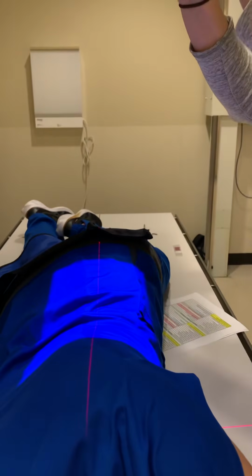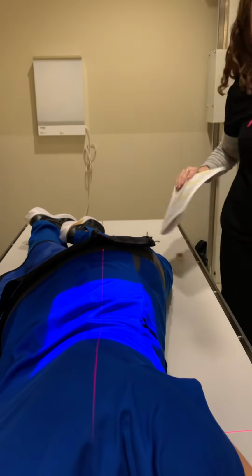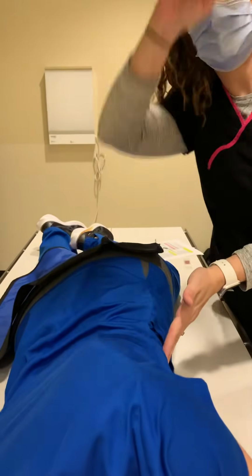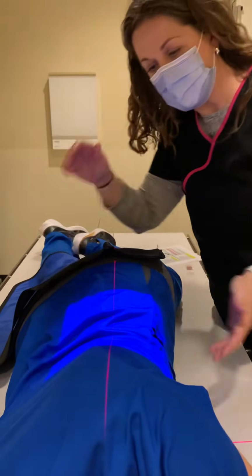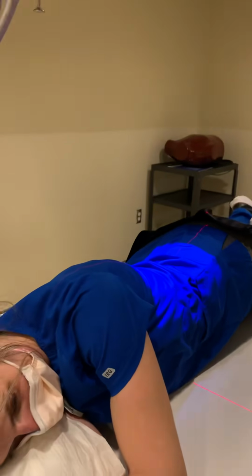We are at 40 inches. We have lead shielding on our patient. If you have a hypersthenic patient, they require more rotation. We are going to suspend breathing at the end of expiration.